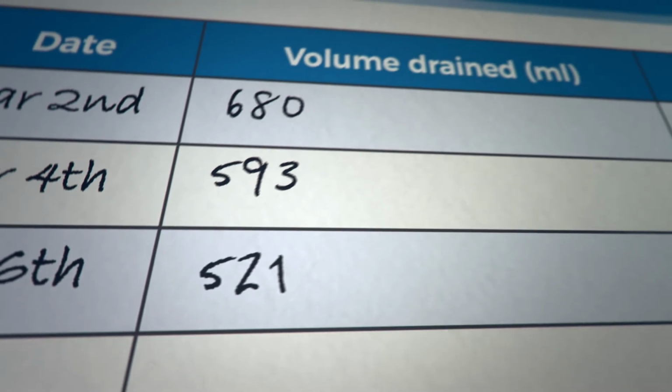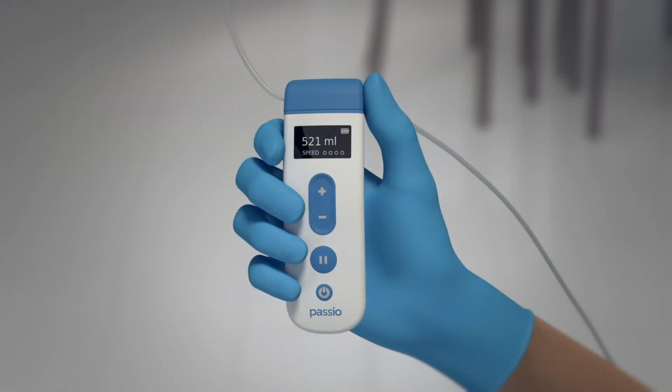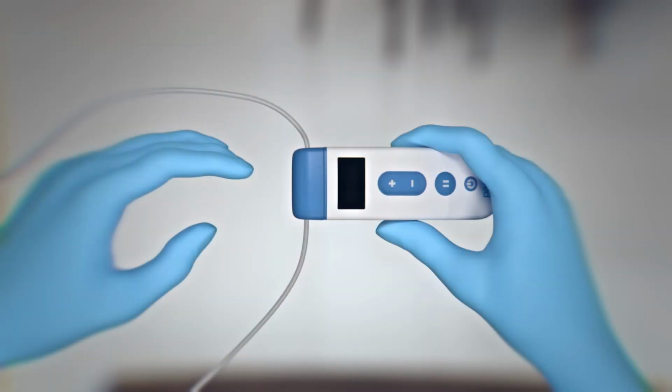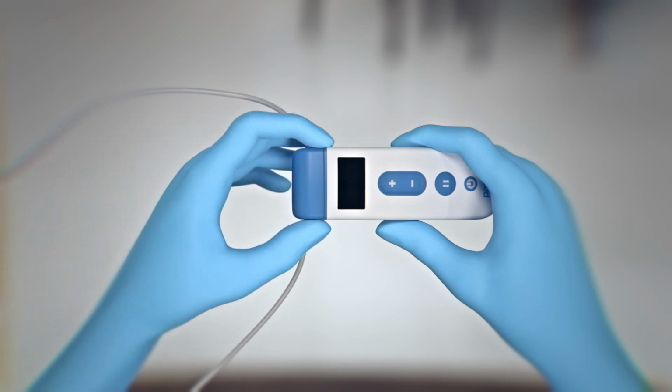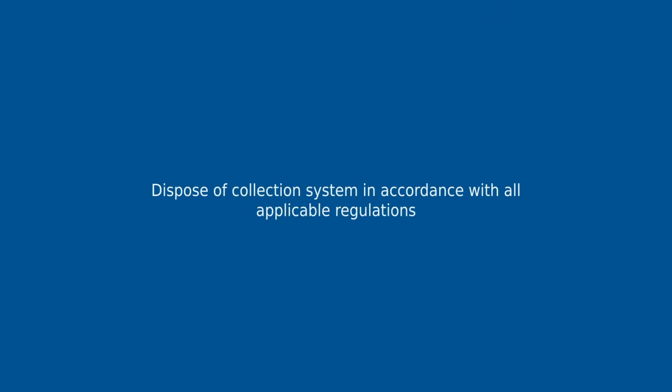Record the amount of drainage displayed on the handheld control unit display screen. Press and hold the power button for 2 seconds to turn off the power to the unit, and store the unit until the next drainage therapy session. To finish the therapy session, remove the pump head from the Passio handheld control unit and dispose of the pump head and collection bag. Dispose of the collection system in accordance with all applicable regulations.